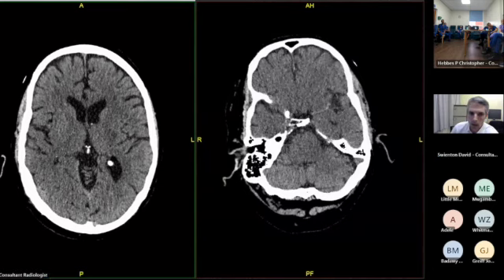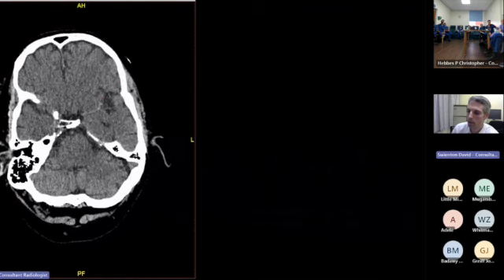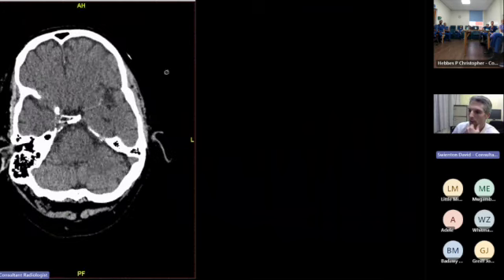And just going back to what does a hyperdense vessel mean? Again, people shouldn't be saying the words hyperdense vessel, unless what they mean is there's a clot in this vessel. So this chap had a stroke, and it's very, very subtle. But here's his middle cerebral artery. Can you see it's got these sort of brighter bits? And again, I appreciate it's a bit subtle on this one. If I wanted to pull out a dense vessel, I probably would have found a better one. But he just happens to have one, and it links to the first case. So a hyperdense vessel suggests clotted blood, and in the context of stroke would be relevant. So that's a plain CT head and what it looks like.